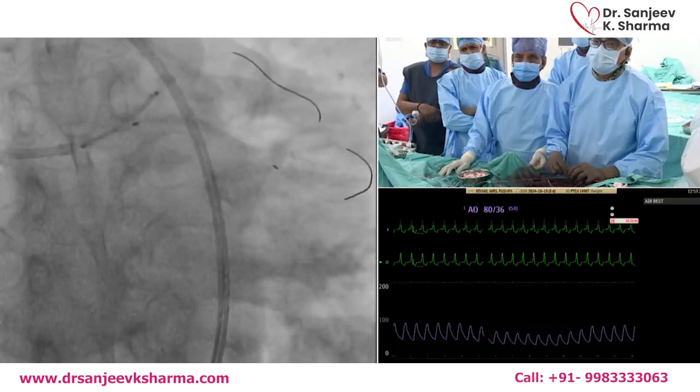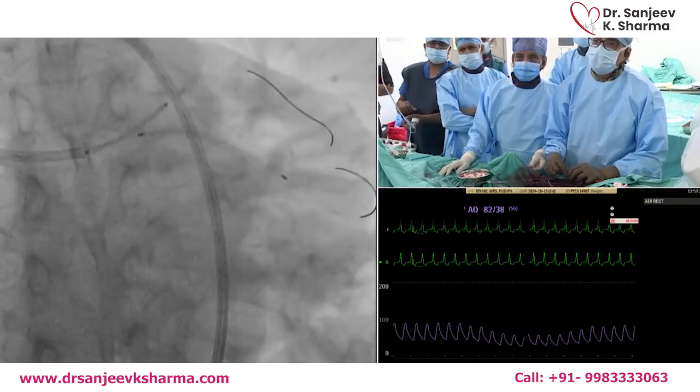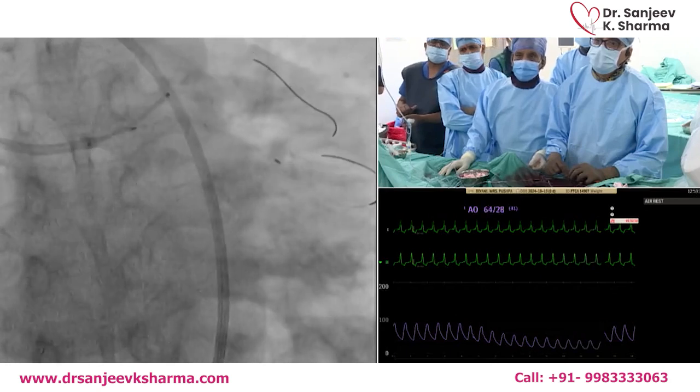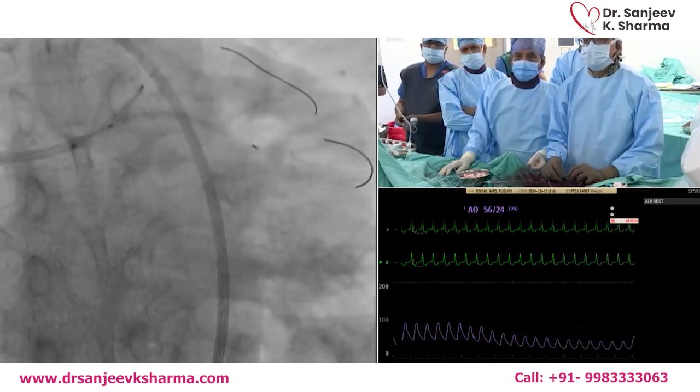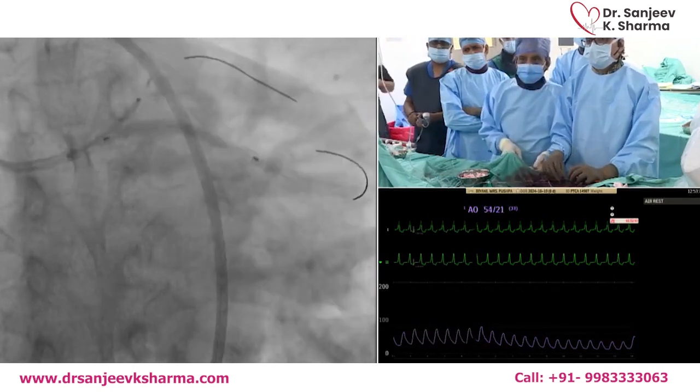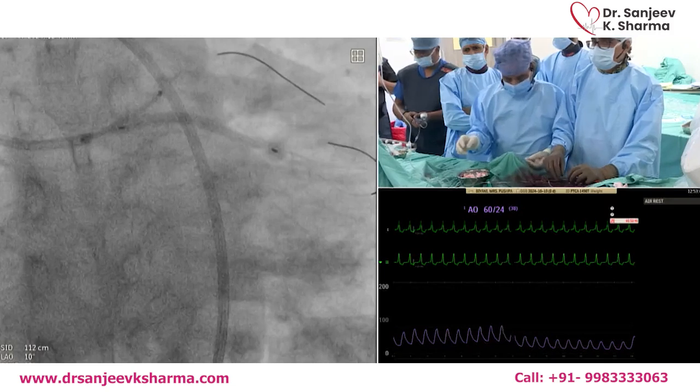I will come back a little, and then you can go a little higher. So this becomes, I would say, a modified DK crush, where your ostium you have opened it now. A little more, 20 now. Save. Very good.